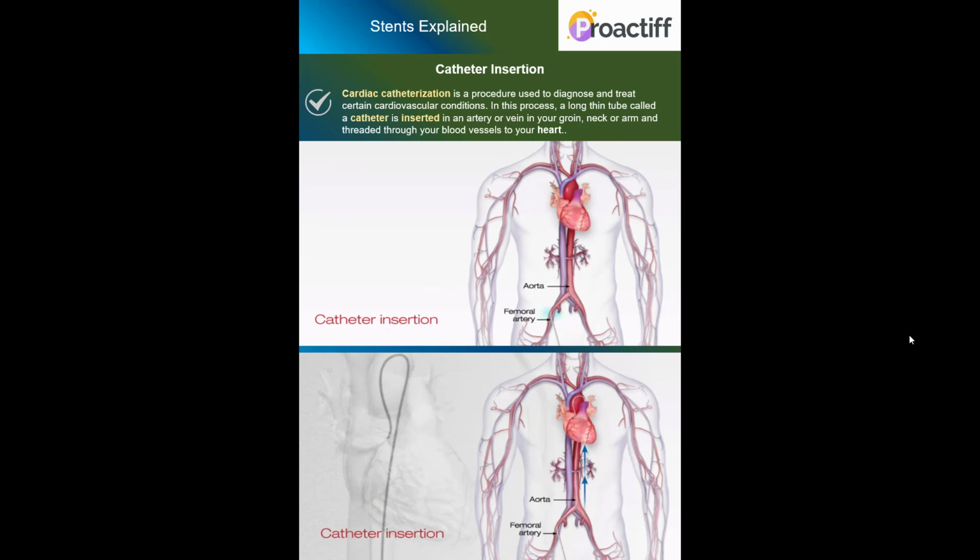Catheter insertion. This is one of the procedures performed by skilled experts, who are essentially cardio specialists. They perform this procedure, and it is used to diagnose and treat certain cardiovascular conditions. We're going to understand more of it.